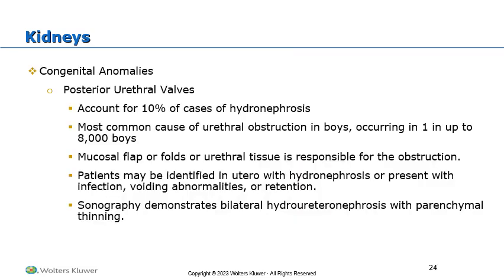Okay, posterior urethral valves. We've talked about this quite a bit, and I know you looked at it in OB. This is a very concerning abnormality. With posterior urethral valves, we often teach that this is non-compatible with life. Some cases might not be as severe as others, so it is possible that you're going to have a live infant with a posterior urethral valve. Remember that they develop that keyhole type bladder. These account for about 10% of hydronephrosis cases.